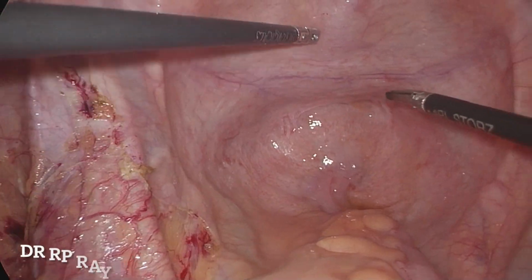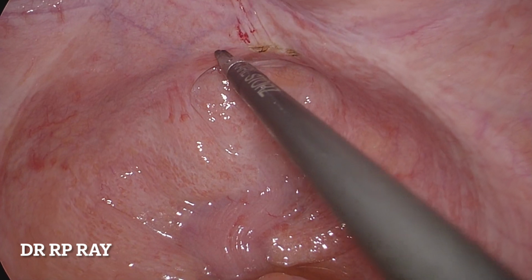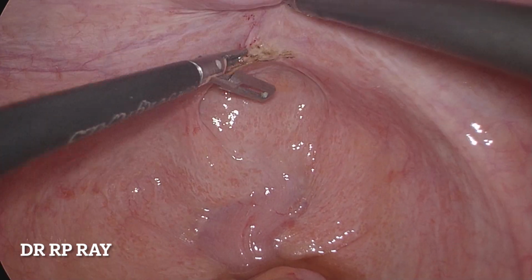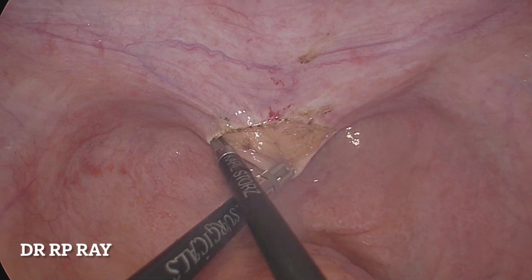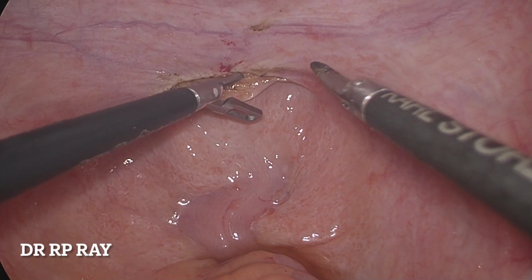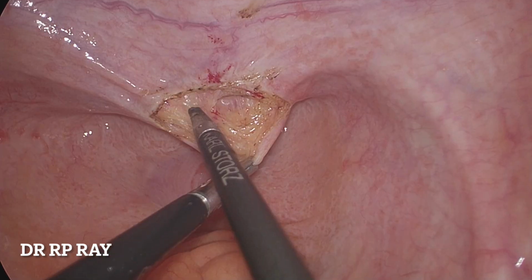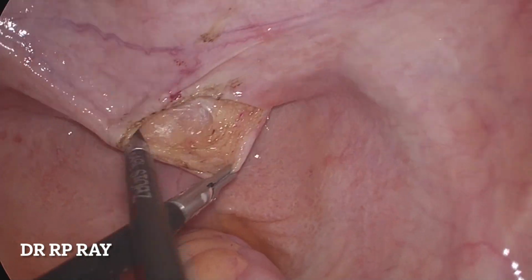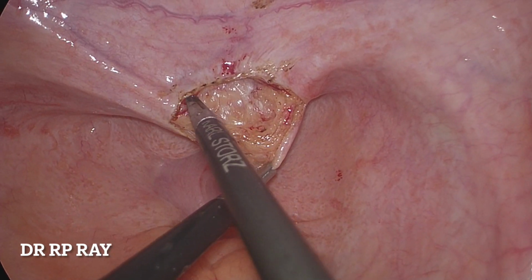First part is posterior dissection. Incision is made on the peritoneum at the rectovesical pouch, and then the dissection is continued in between the prostate and the rectum. There may be some small bleeding which can be cauterized using bipolar forceps. The dissection is continued and try to identify the seminal vesicle or the vas deferens.